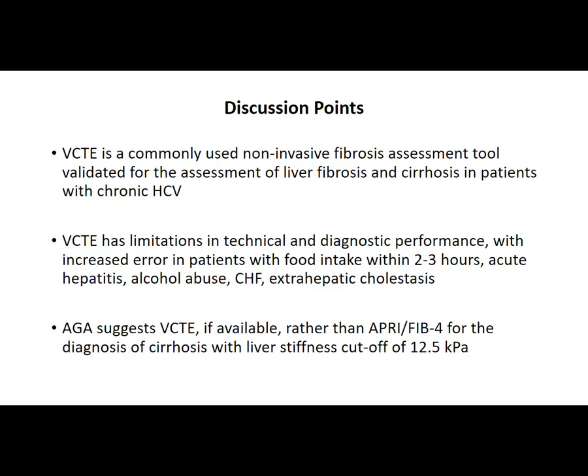So it's commonly used. There are a lot of them now across the US. It does have some technical and diagnostic limitations. Increased error, higher numbers in people who have just eaten, in acute hepatitis, people with high liver enzymes, alcohol abuse, congestive heart failure, and extrahepatic cholestasis, all of which would actually increase liver stiffness.